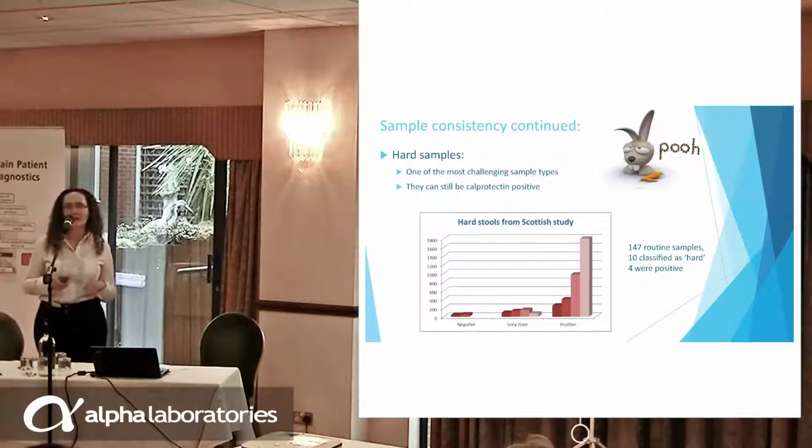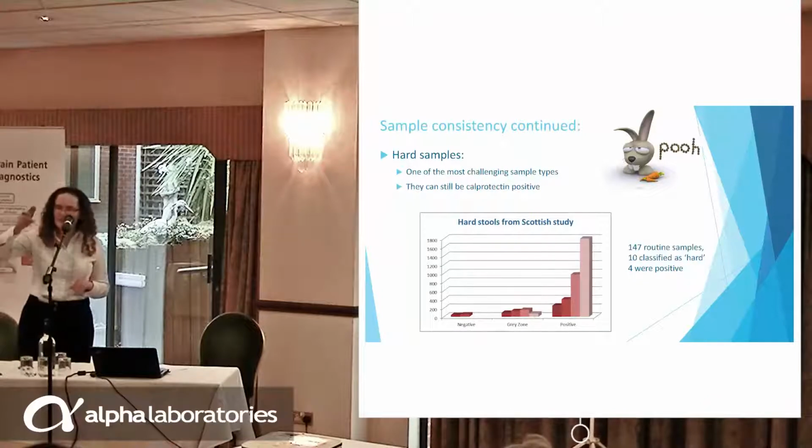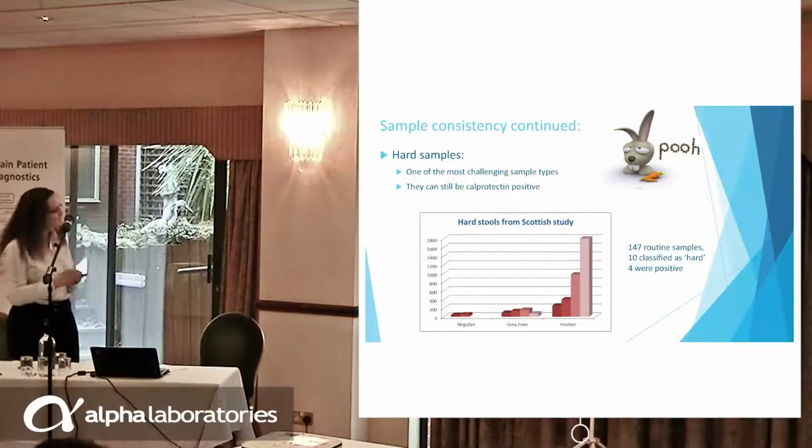And I do appreciate that they are a really quite challenging sample to do. If it was me, I would try and trap them against the side of the container and squash them, because if you try to stab them, they're just going to ping around the lab, which is not good.